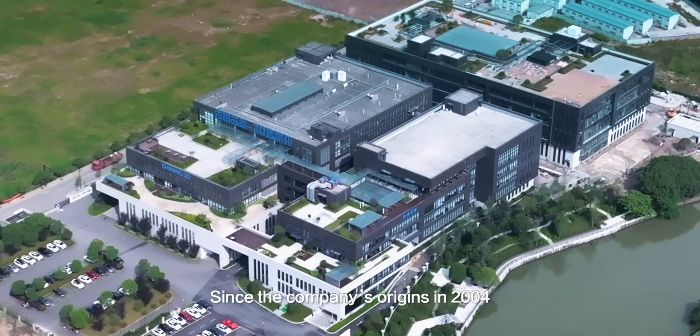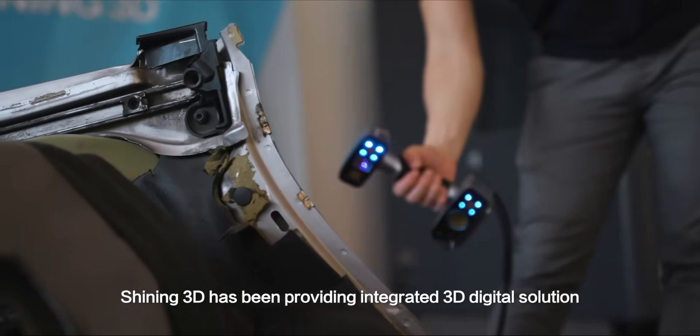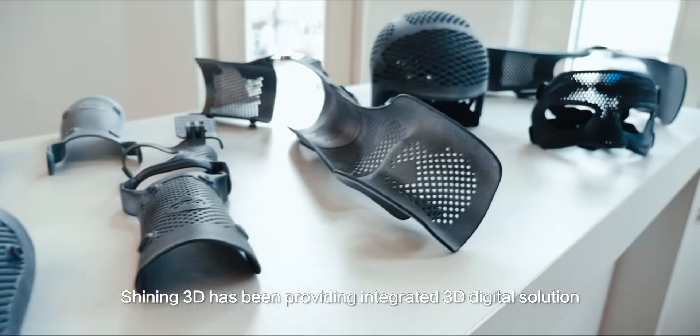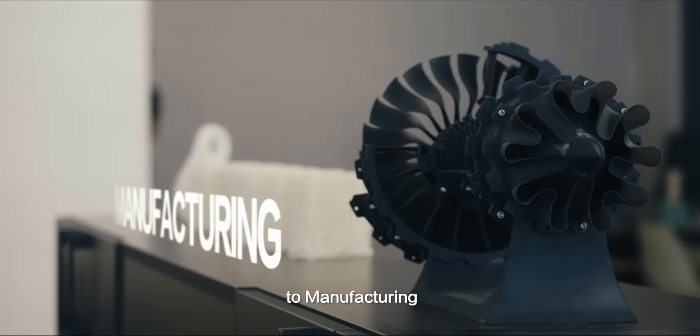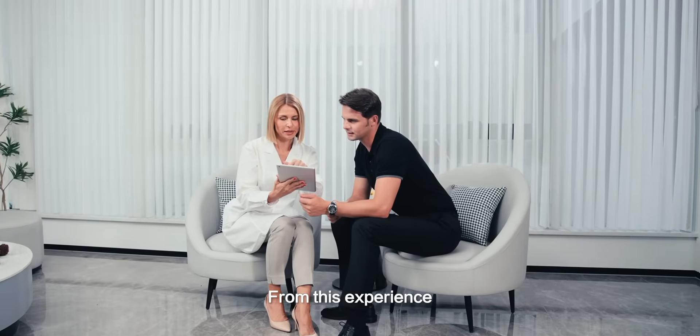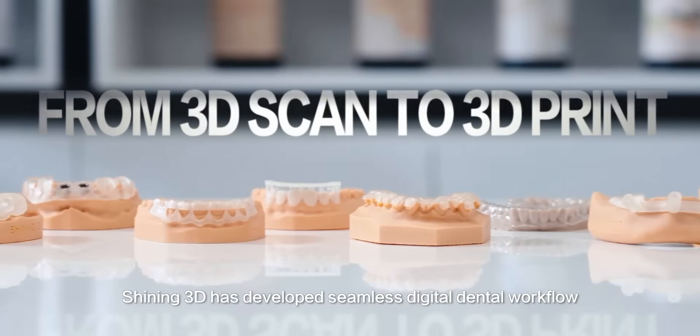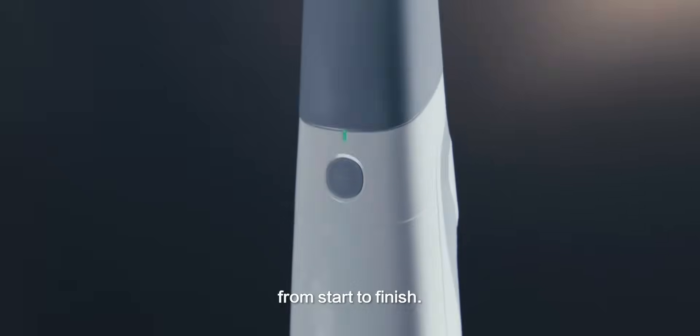Since the company's founding in 2004, Shining 3D has been providing integrated 3D digital solutions to manufacturing, healthcare, and metrology industries. From this experience, Shining 3D has developed a seamless digital demo workflow from start to finish.